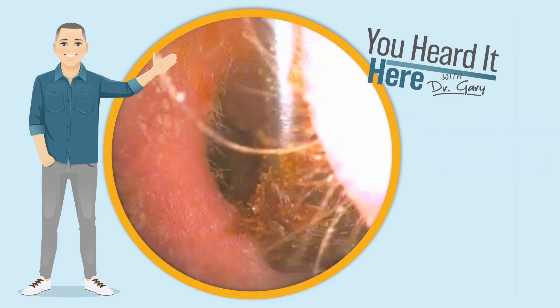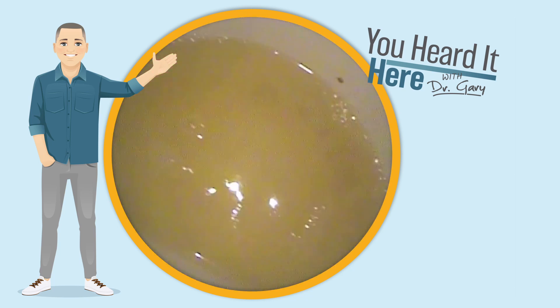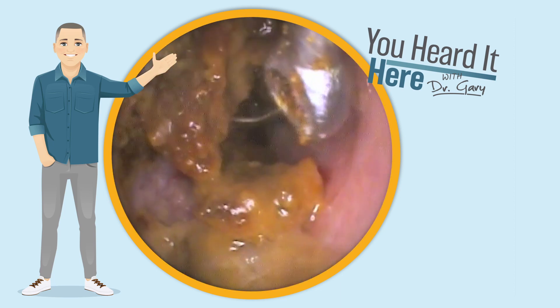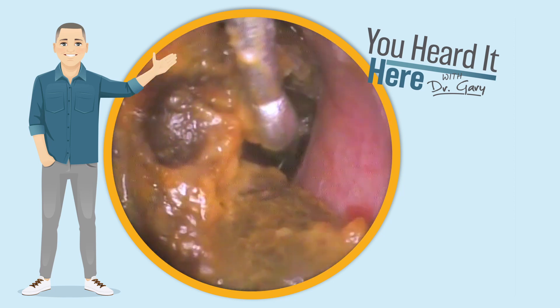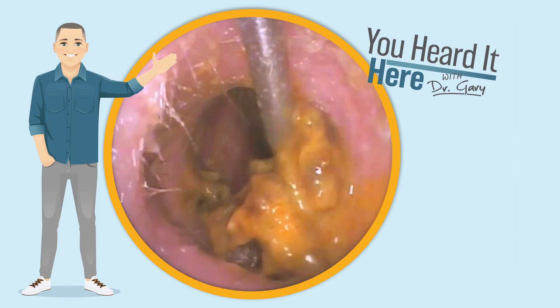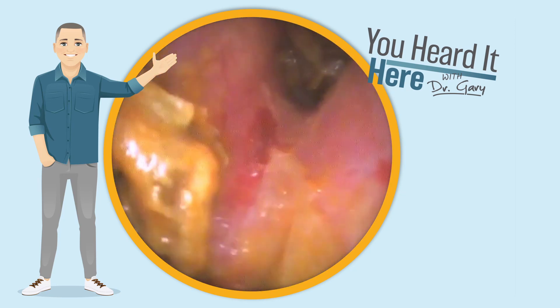As you can see, we're using the curette to take out some large chunks of wax, and then we use some irrigation. Look at how yellow that water is. After the irrigation, we can see the eardrum, but there's quite a bit left on the ear canal walls. So we're again going to use the curette to remove the big chunks and then hit that last little bit with another round of irrigation, just to pull that tiny debris off the sides and away from the eardrum.